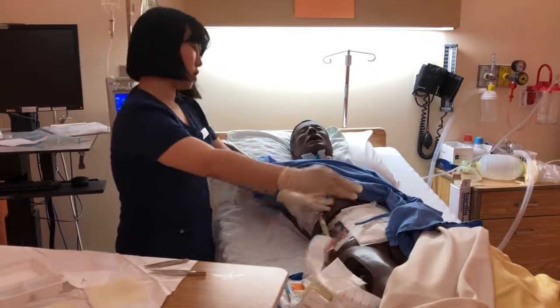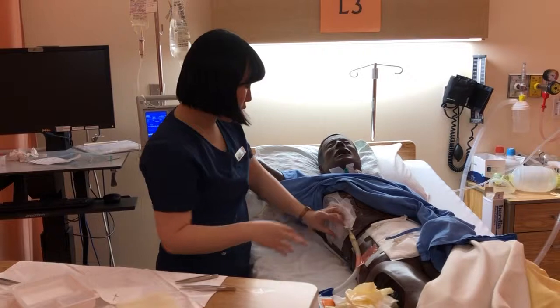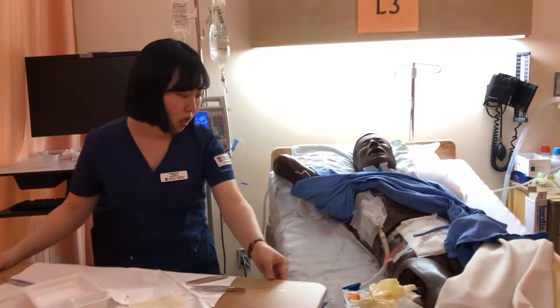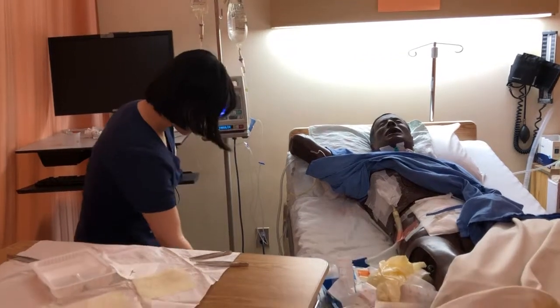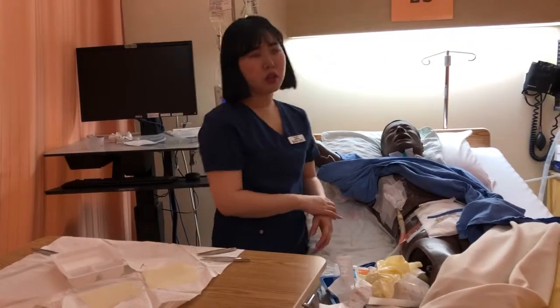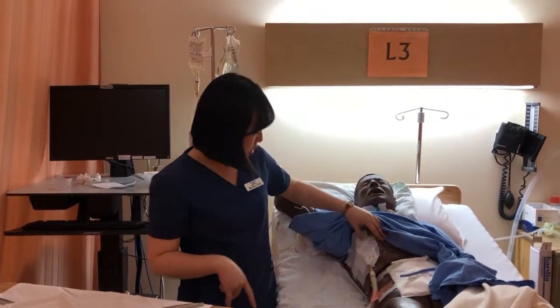So it's good, safety checks good. Patient doesn't look visibly distressed, and the chest tube is working well. And I'm gonna document the drainage and the dressing.